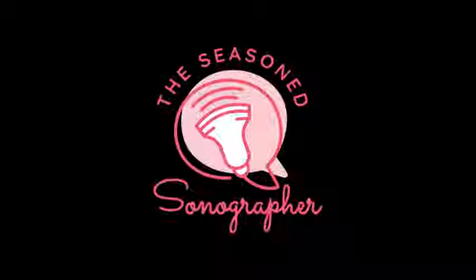If you could give sonographers one key message about umbilical artery Doppler in fetal growth restriction, what would it be? It's just get comfortable with the technique. Learn the technique, do it right, because it does change management. And the goal is early detection of fetuses who are not getting enough oxygen and nutrients due to poor placental function.